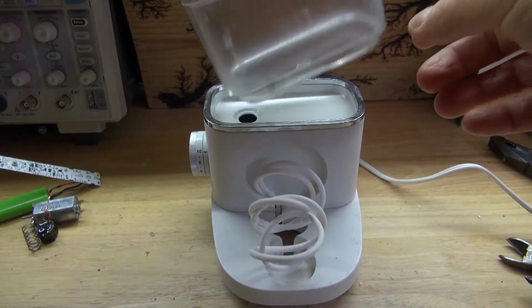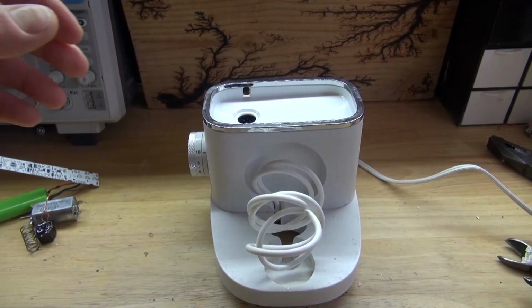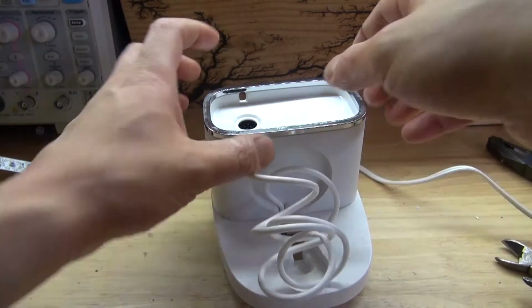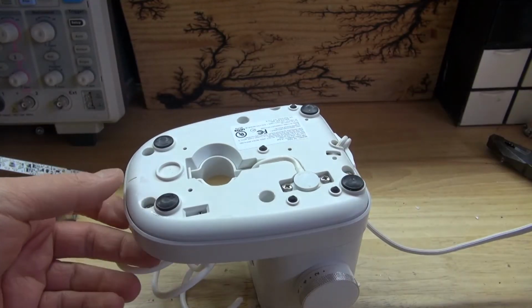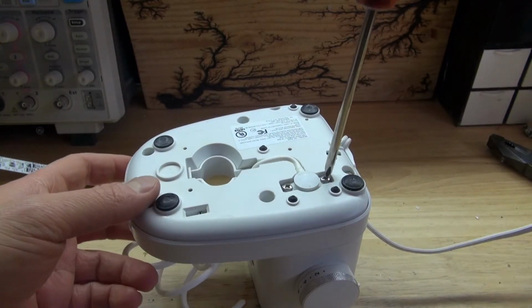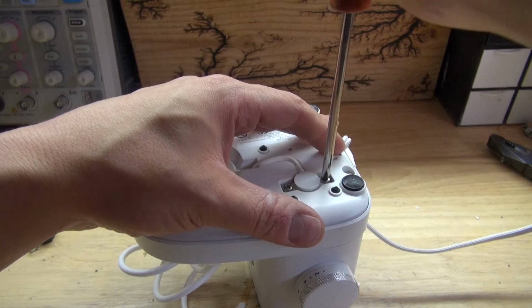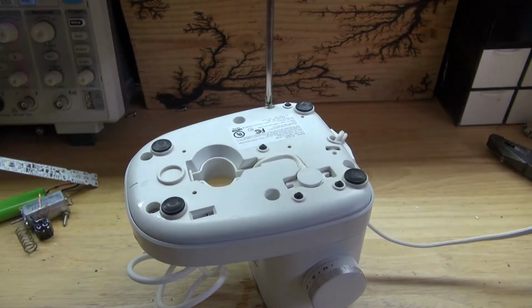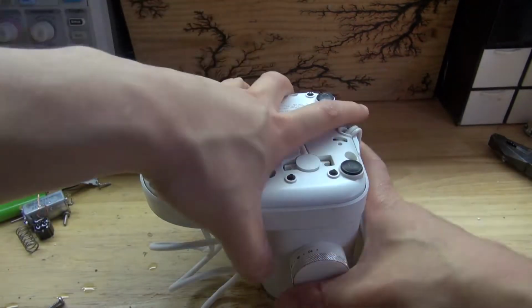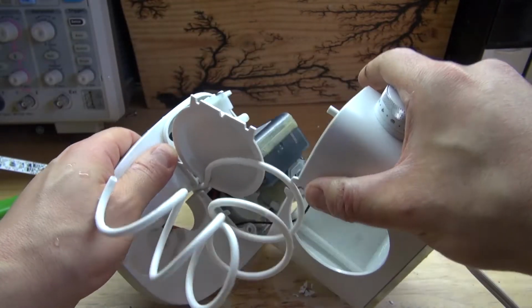Next, I'm going to go ahead and work on the second part of this device. Simply remove the unnecessary parts. And you can see there's a lot of obvious screws. So again, see a screw, take a screw, see a screw, take a screw, and remove all of the screws that I can find. And there, all the screws are now removed, and now it's time to open up the housing.